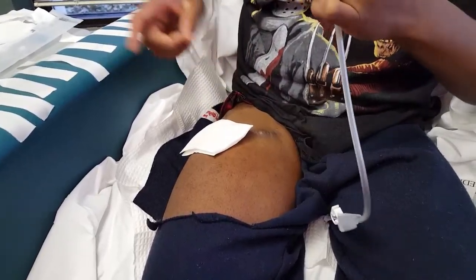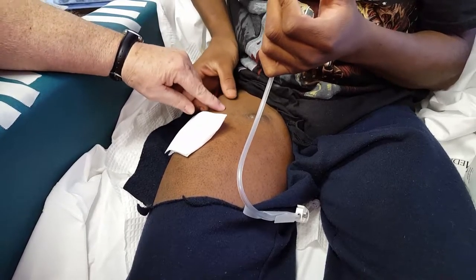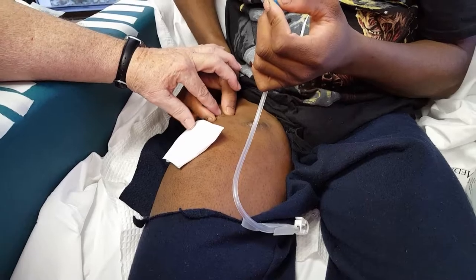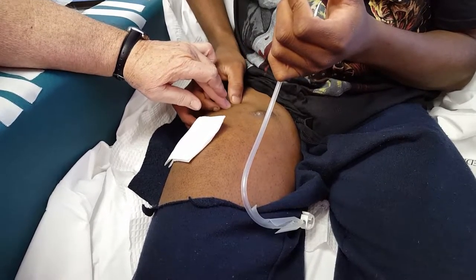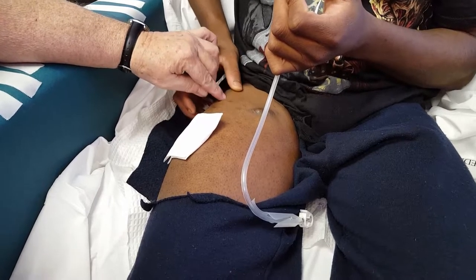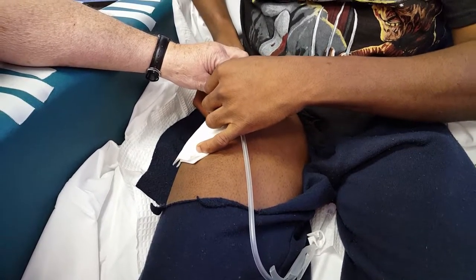Okay, here we go. Can you help me? No, I mean pinch it. Well, I have to see where it's at. Let me feel it too. The last time I made that mistake. I'm going to go up a little higher, right about there, where my fingers are. It's right there. Right there? Yeah. Do not stick me.